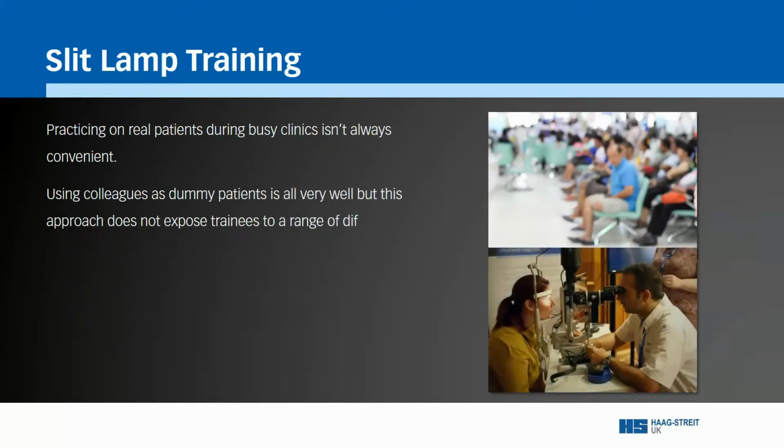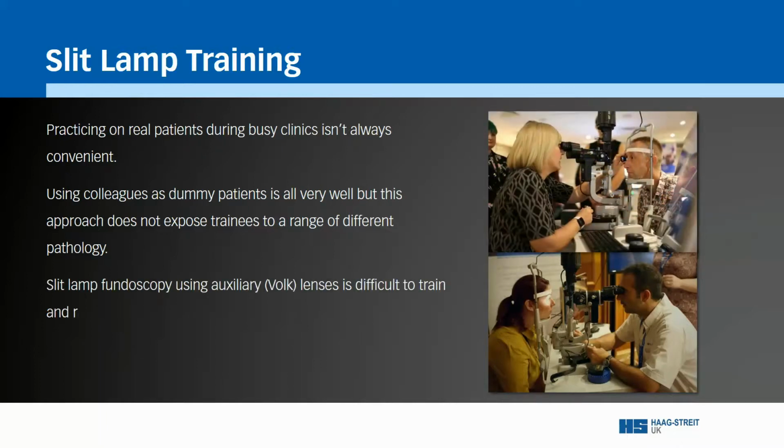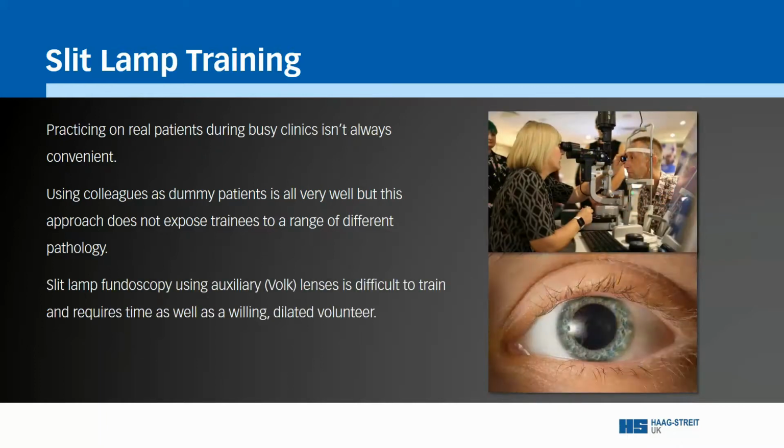Of course, practicing on colleagues is useful, and it's an approach that we have utilised during our live training courses, with attendees taking turns to examine each other. But it's unlikely that trainees will be exposed to a wide range of disease using this method. And of course, fundoscopy is difficult to train at the best of times, requiring as it does boundless patience on the part of both teacher and student, not to mention the subject with their requisite dilated pupil.